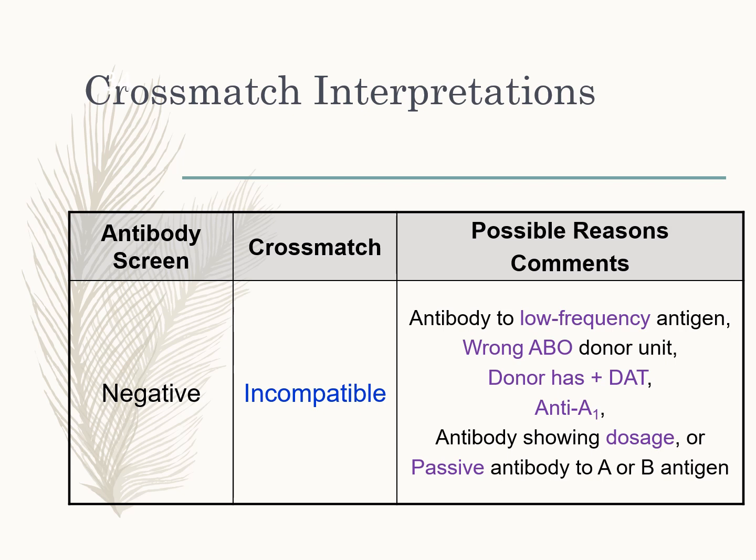Or it could be passive antibody if the patient's been getting a lot of plasma or platelet transfusions. It could be those donor antibodies that are passively circulating in the patient's blood and causing an incompatible crossmatch.